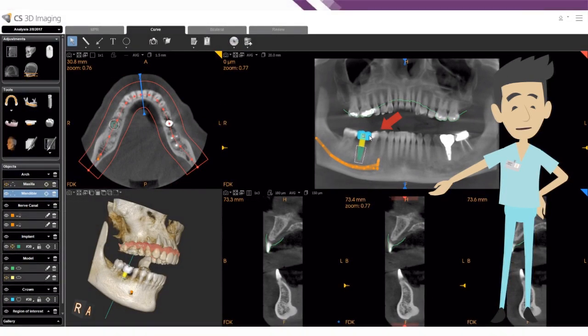To avoid manipulation errors when objects overlap, you can now lock and unlock implants, crowns, and wax-ups.